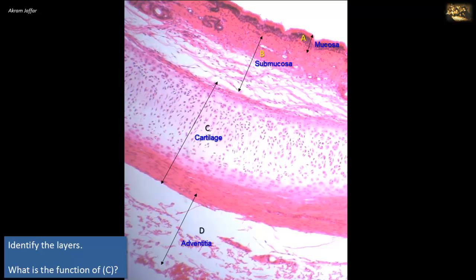So this respiratory passage is not a bronchus, although the full extent of C is not shown, the cartilage is in fact in the form of a C-shaped cartilage, rather than in the form of small cartilage plates. Small cartilage plates are expected to be present in the bronchus. So this cartilage is a continuous, large C-shaped cartilage, a feature of the trachea. There are about 16 to 20 of these C-shaped hyaline cartilages. Some anastomose with adjacent cartilages.